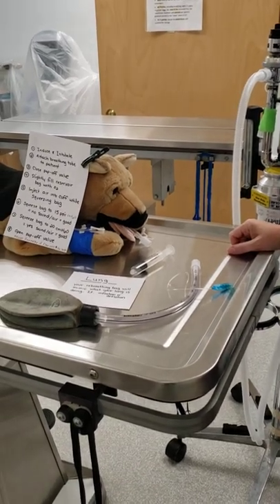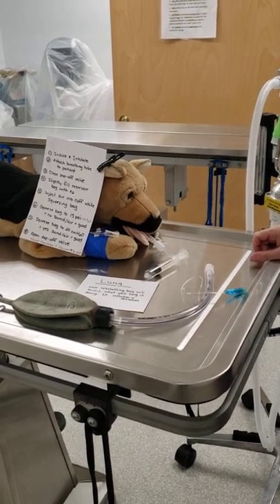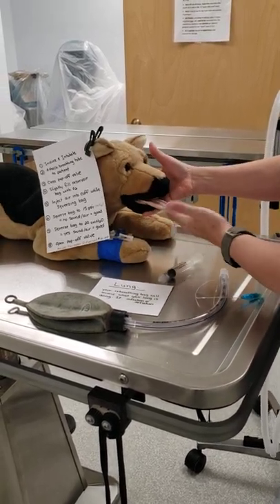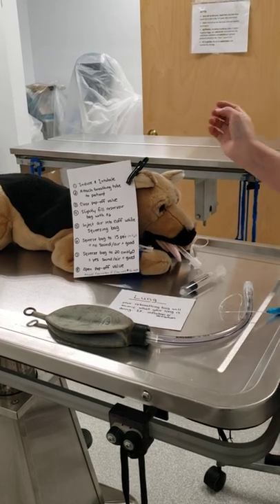What I'm going to be showing you is how to properly inflate the cuff on your endotracheal tube after you've induced and intubated your patient. So after you've induced and intubated your patient, this is what you see. The endotracheal tube is sticking out of your patient's mouth, but what you can't see is the lungs and what's going on inside.